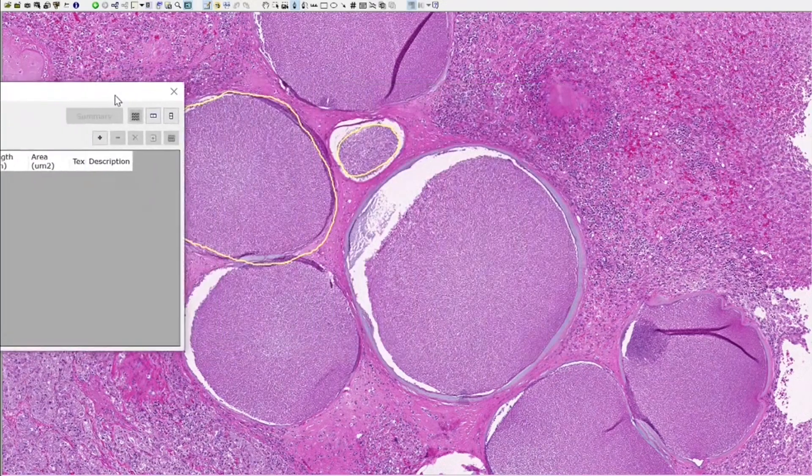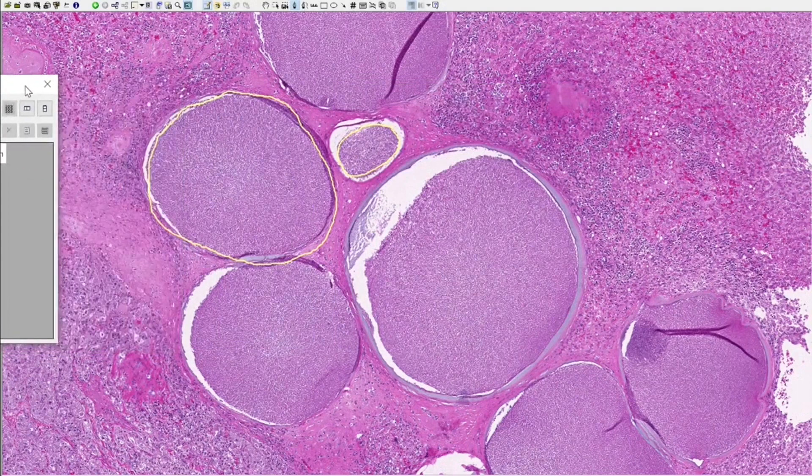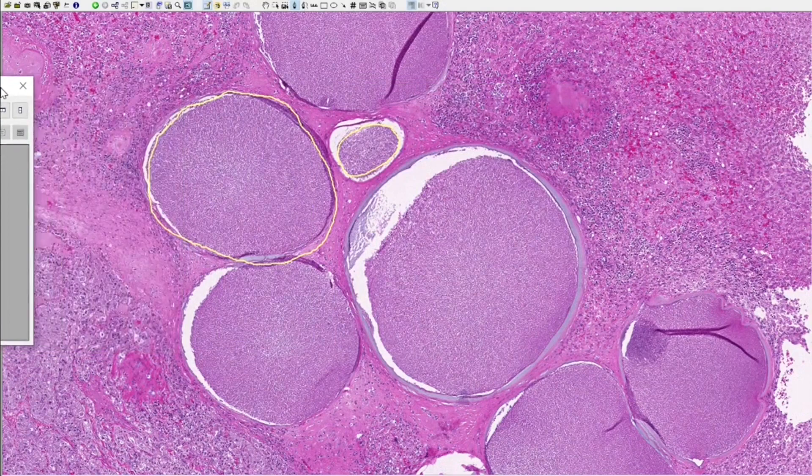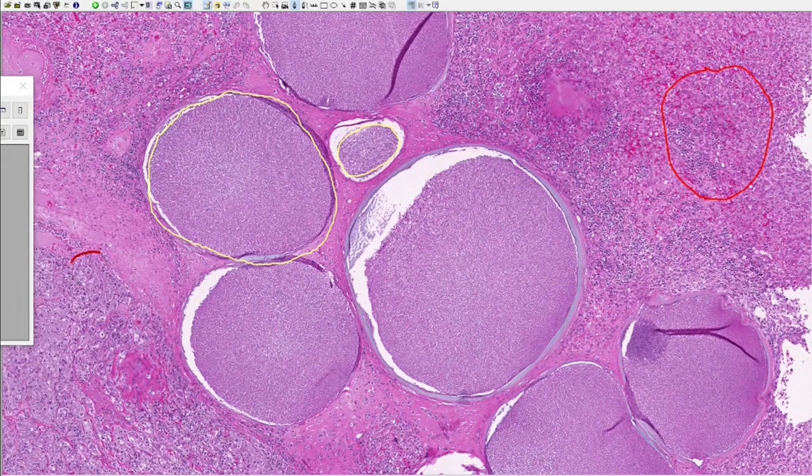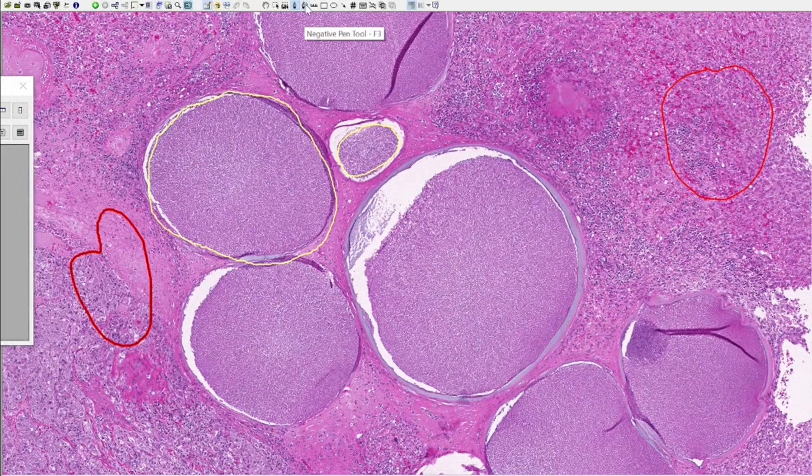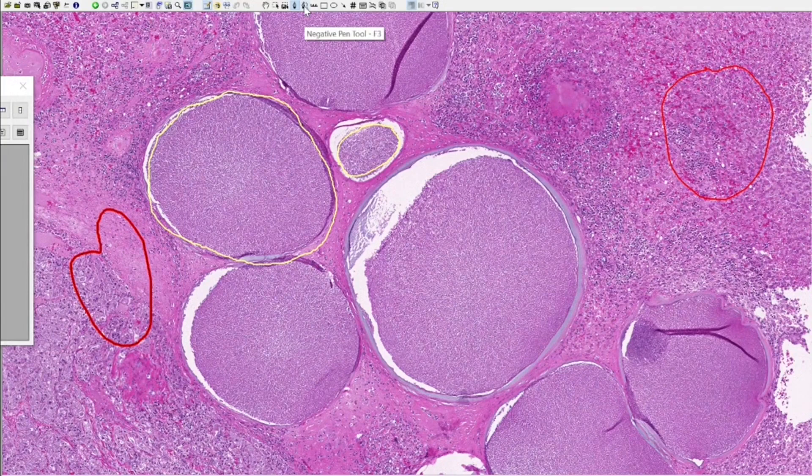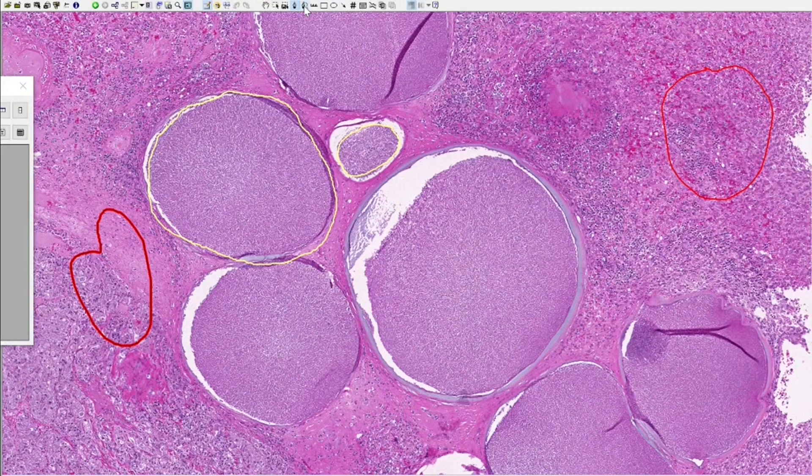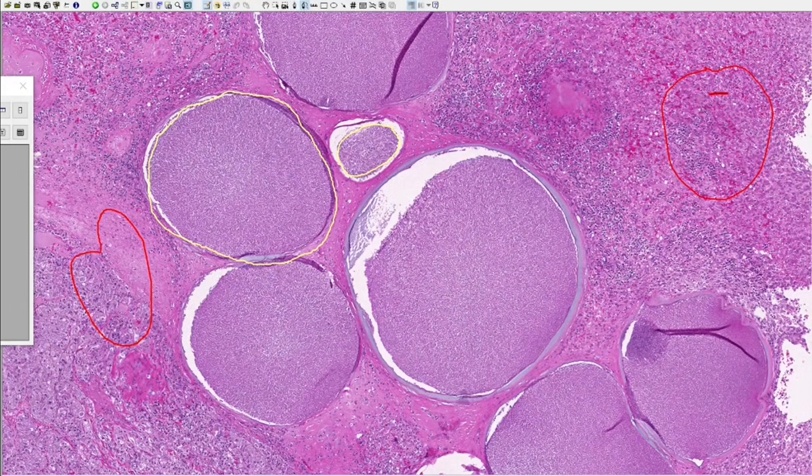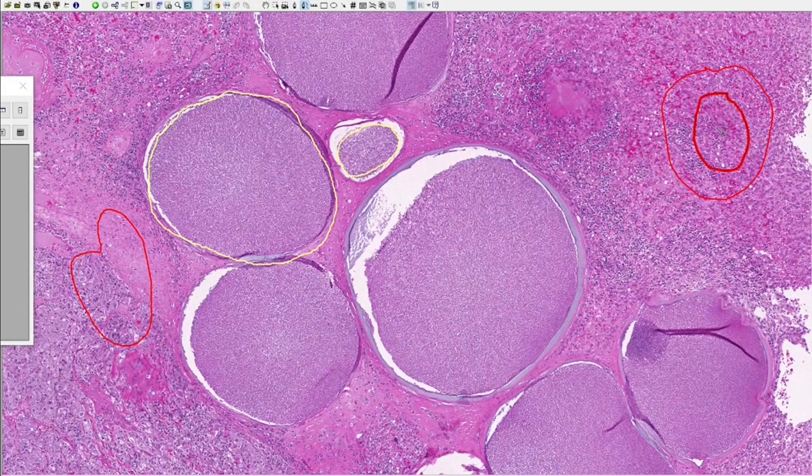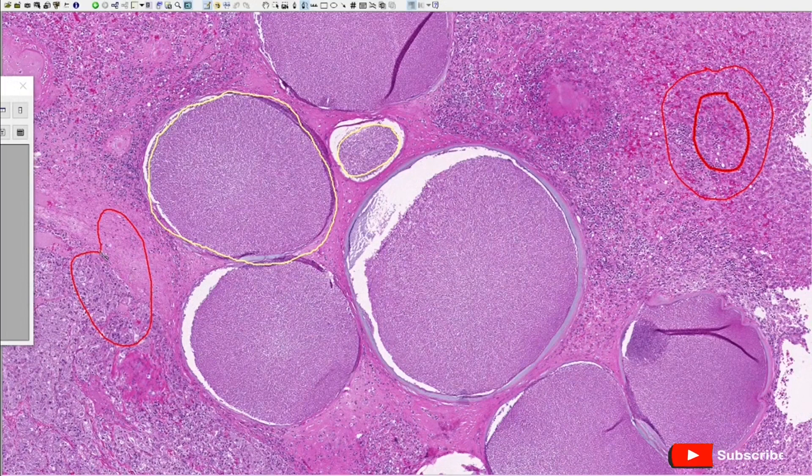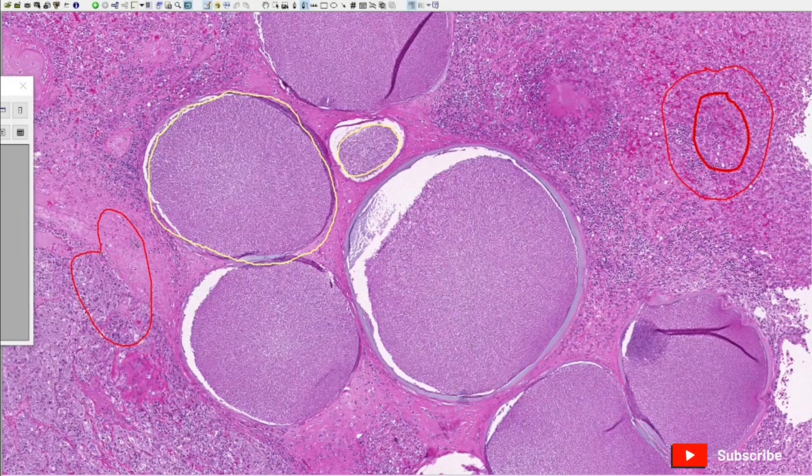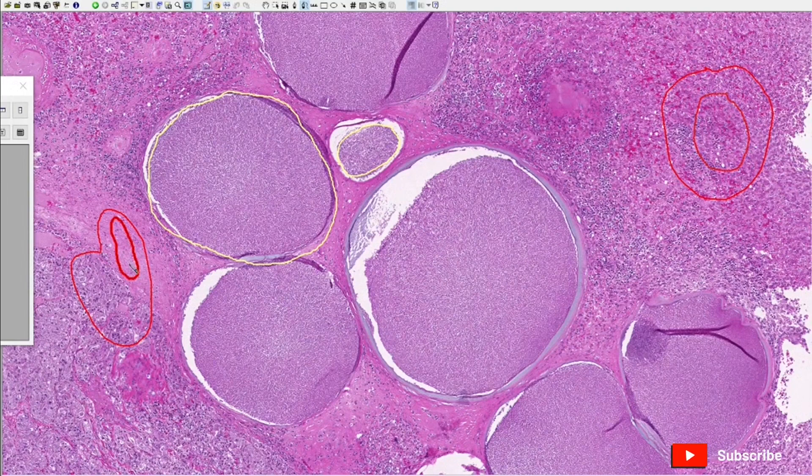Just move it to the side and I'm going to annotate tissue, just example annotations. The next pen here, the pen with a little dotted line, is the negative pen tool, meaning you can make holes in your annotations. So if I want to make a hole here, this is the negative pen that I'm using. Then my annotations only the outside ring of this donut, for example. Here, if I wanted to exclude something, I do the negative annotation as well, and then my annotations only the outside.